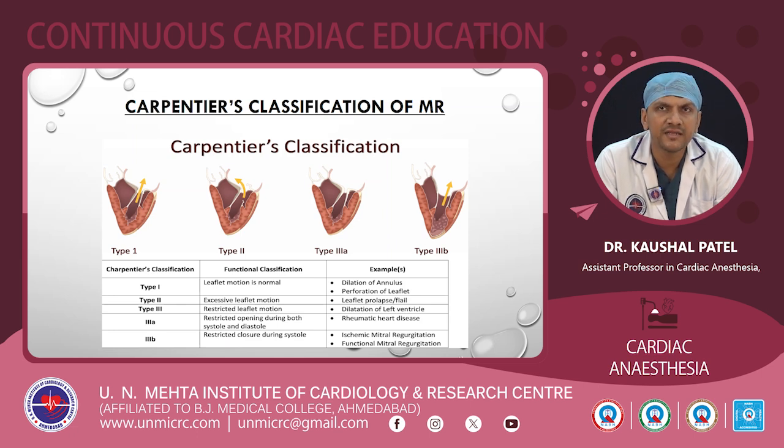The examples are ischemic mitral regurgitation and functional mitral regurgitation. So what happens in ischemic and functional mitral regurgitation? During ischemic mitral regurgitation, the annular size stays the same, but the LV becomes dilated. During the dilatation, the tethering force and the closing forces are unequal, so they are inadequate to close the mitral valve.